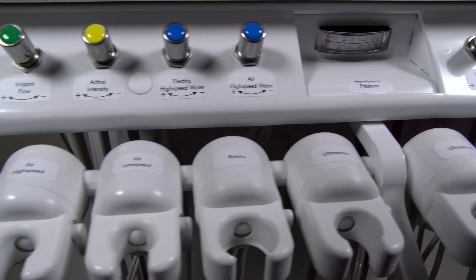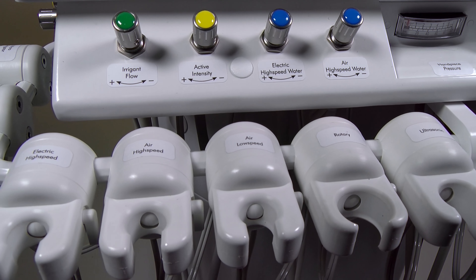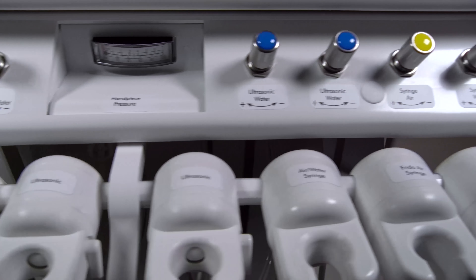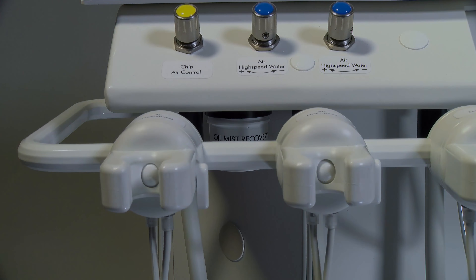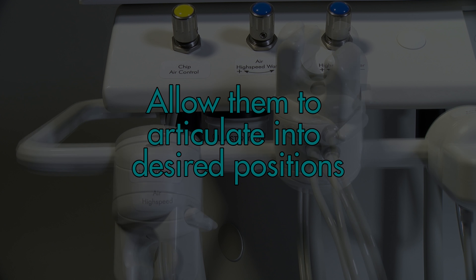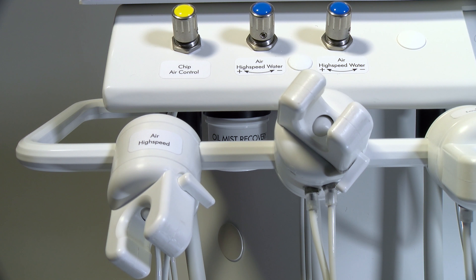ASI's handpiece holder design provides true fit capability to provide an exact fit for the air and electric instruments. The holders feature robust and spring-loaded capability to allow them to articulate into desired positions from up and down, left to right, as well as the ability to slide along the bar for preferred placement.